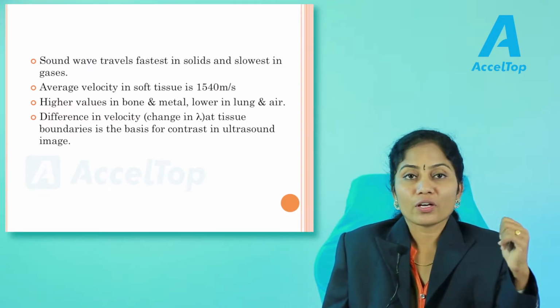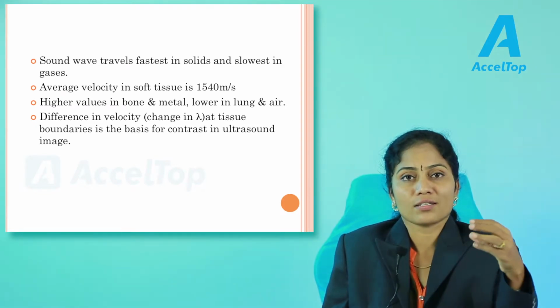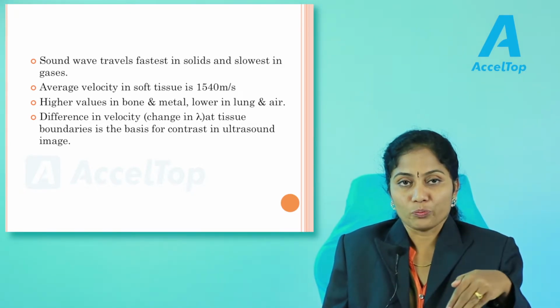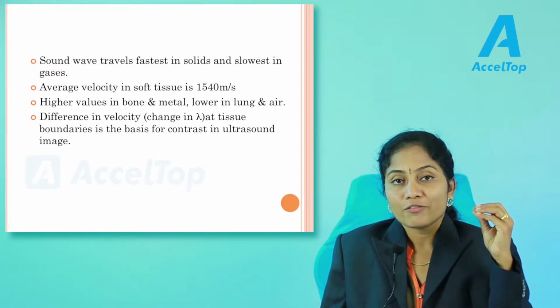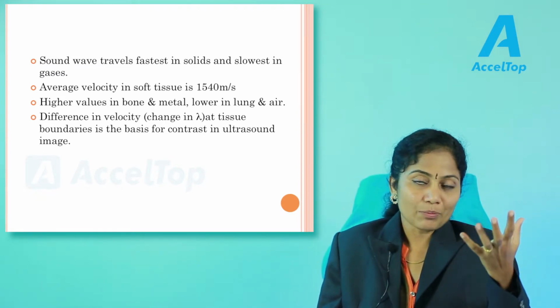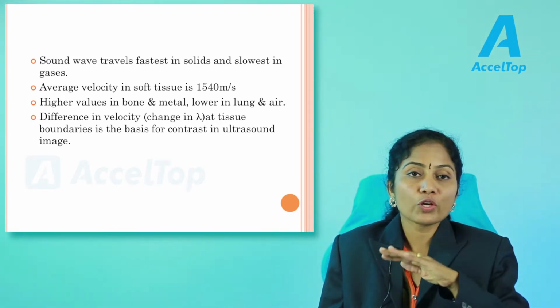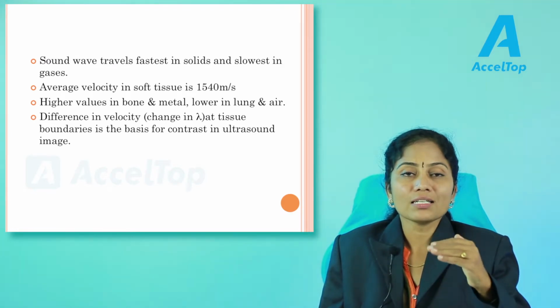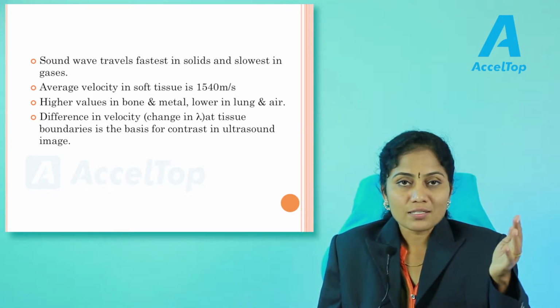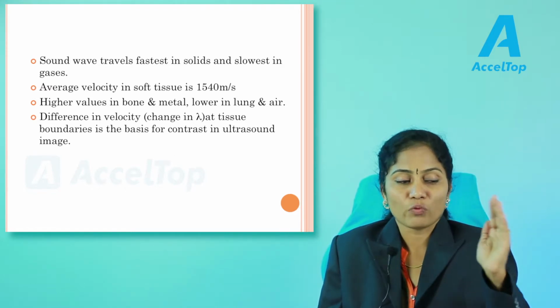As we would have seen in our younger days, sound waves travel fastest in solids and slower, or not at all, in air and in vacuum. This is a very important physics concept that we use in ultrasonography, because before scanning the patient we apply a gel over the patient and then put the transducer. This is to replace the air layer, and it also acts as a matching layer between the transducer and the patient's surface. So just remember, sound travels fastest in solids and slowest in air and vacuum.